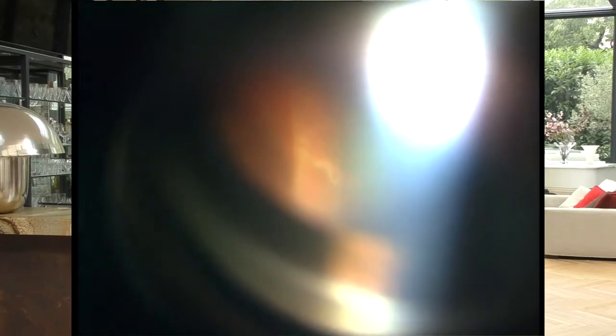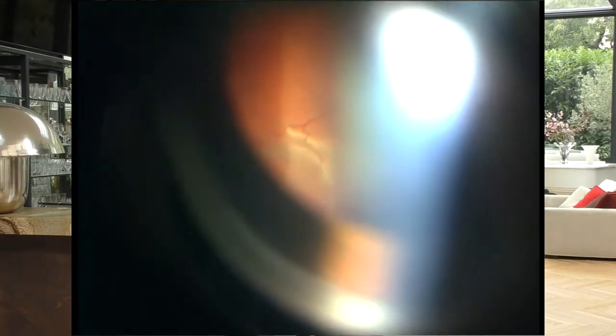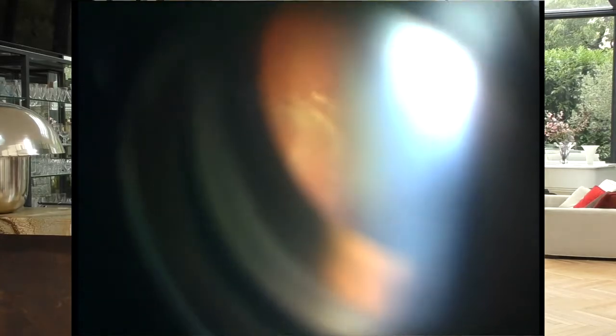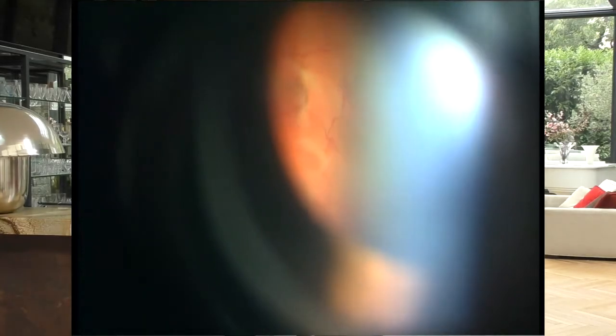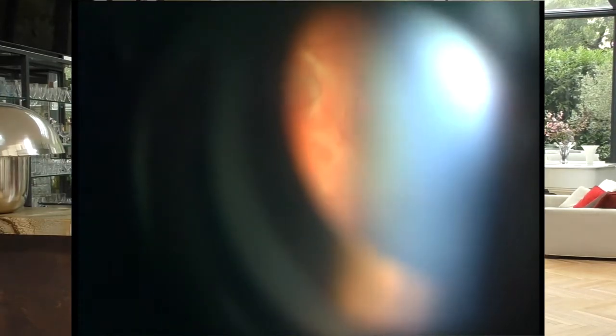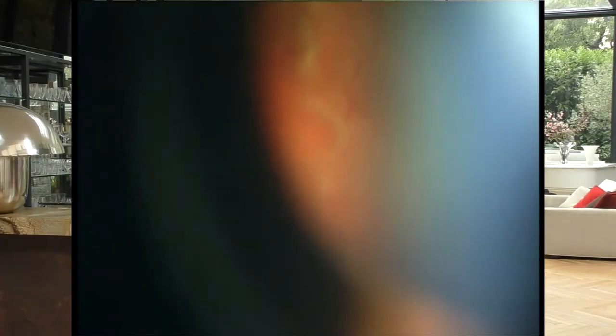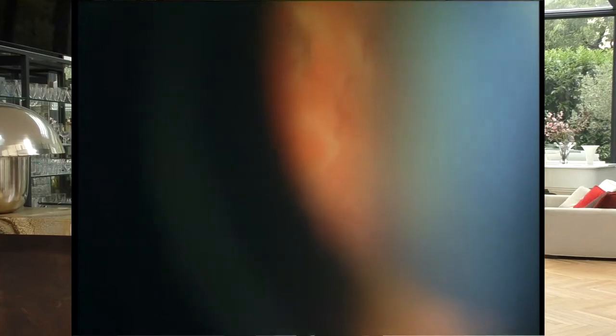Each millimeter of retina is examined continuously without making a jump. Nothing can therefore be missed because everything is checked and listed at high magnification. I counted 5 tears and 2 suspicious areas to be checked intraoperatively.